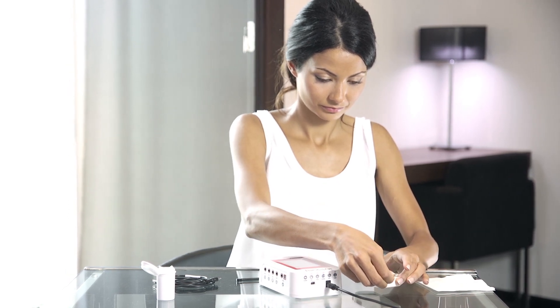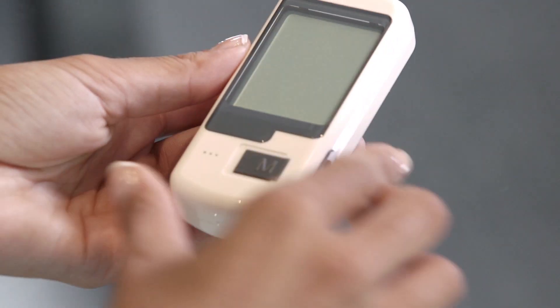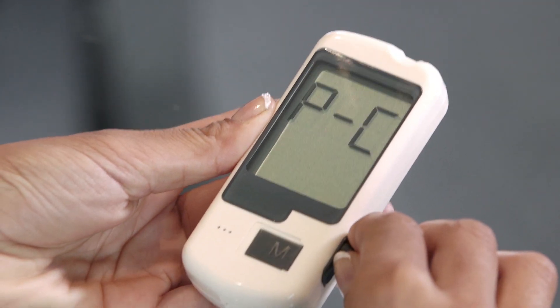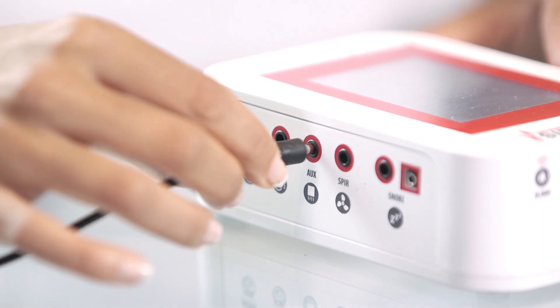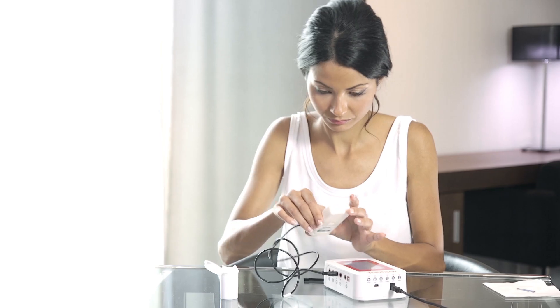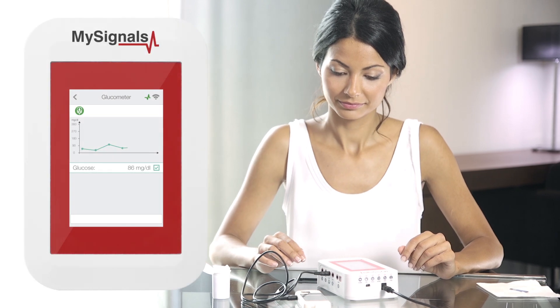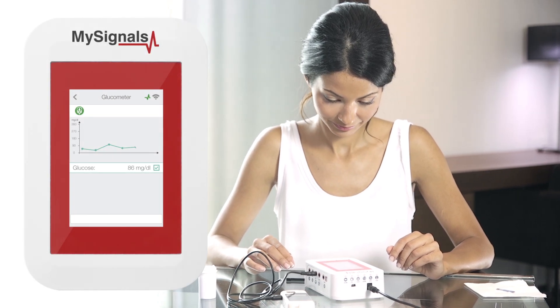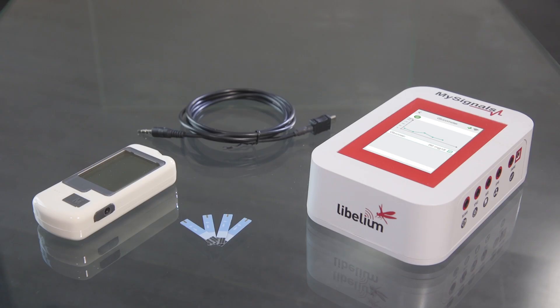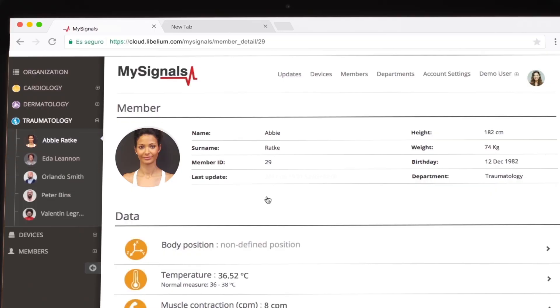You can send the data to the my signals device. Plug in the mini USB connector in the glucometer and the jack connector in the my signals device. Now you can visualize glucometer values in real time on the my signals screen using the standalone mode. Remember, you can also send the data to the cloud by using the Bluetooth and Wi-Fi modes.